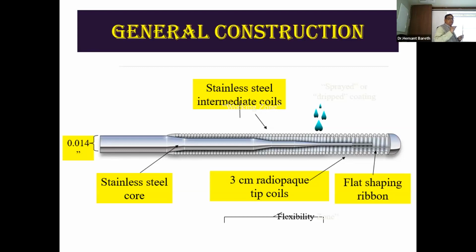Importance of a tapering wire: where you require a lot of tip support, you apply pressure on this big wire 0.014, but the tip has increased pushability because it becomes narrower. And so it can penetrate through even tough lesions. You might even penetrate through fibrous lesions.